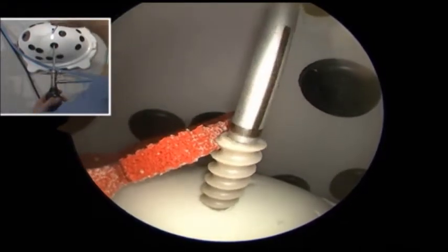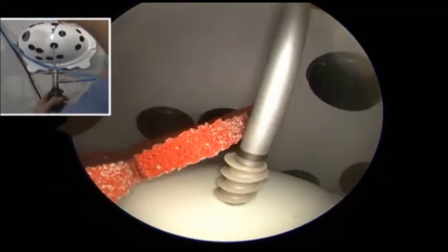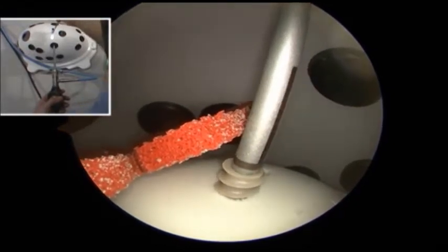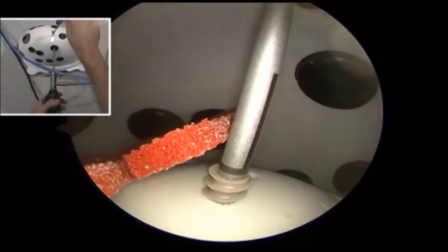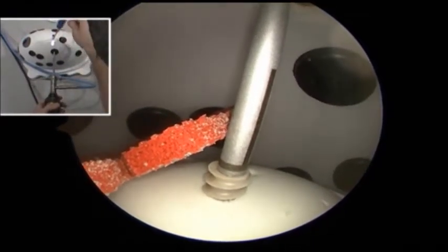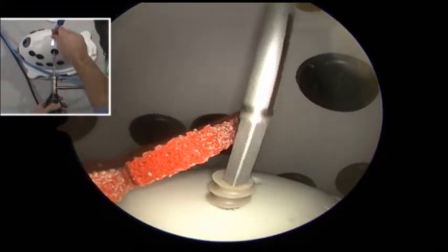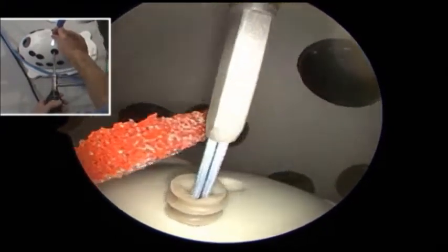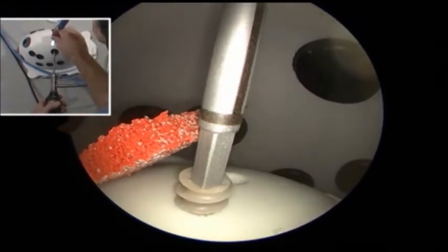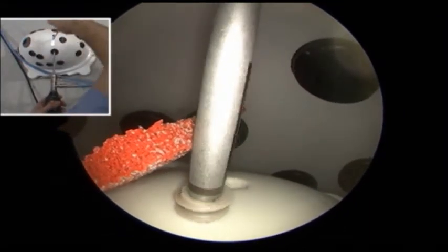when you're doing this in the real situation, you often have blood and tissue and not as good visualization of the cuff margin. And so sometimes when you get down here, you have a little bit of rotator cuff and you're not able to see the actual tuberosity, or you have soft tissue on it and you wonder whether or not you're all the way down. One way to check that is to back this out. You see where the sutures are coming out. At this point, you can still reload the anchor and drive it down further.